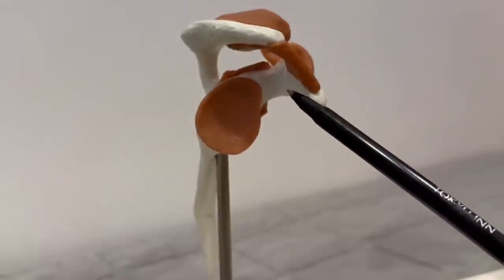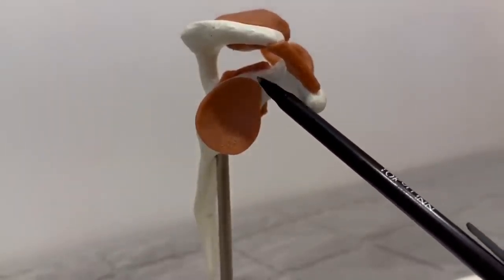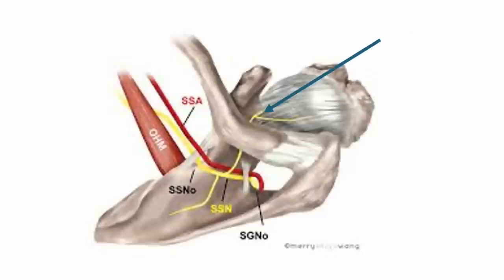If I advance the first target upward, it will be in the superior aspect of the glenoid, underneath the supraspinatus, corresponding with the suprascapular nerve block of the C-arm guided technique. I inject the coracohumeral ligament. Then, retrieve and change the direction to the 12 o'clock position of the articular surface. I infiltrate the rest of the injectant into this target. The second target is the inferior capsule.